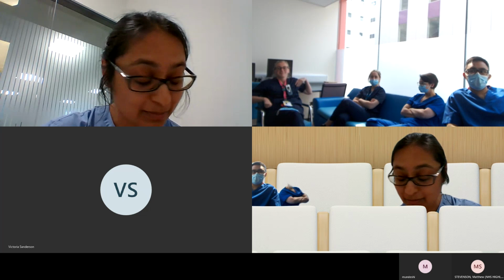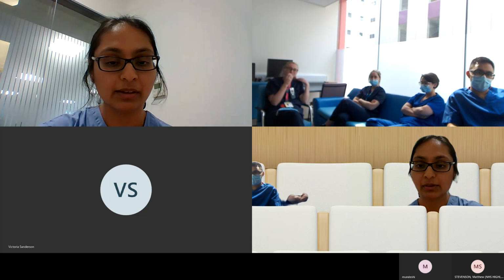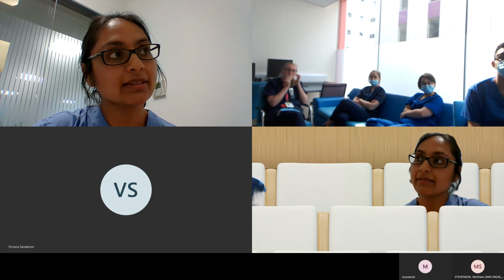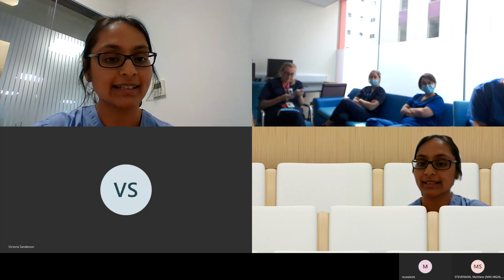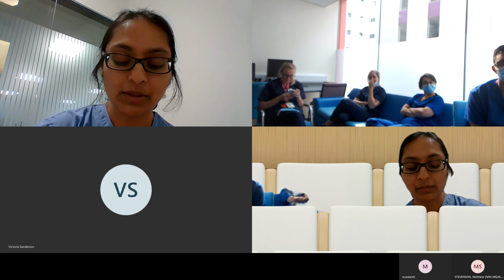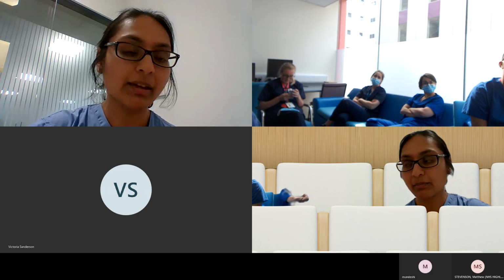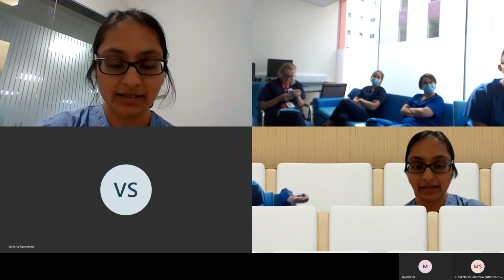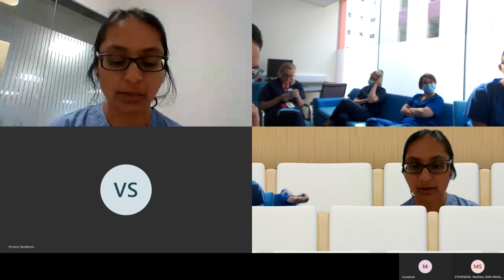It is not exhaustive by any means, but it shows you the flavor of what we get in through the lab, and how having the clinical details to marry up with what we see in the blood film is really useful, because it really changes the quality of the reports that we can produce. Similarly, hopefully now you know what we mean when we say teardrop red cells or fragments or anisocytosis, and it can give you a picture in your mind of what we are seeing under the microscope when you see the report.